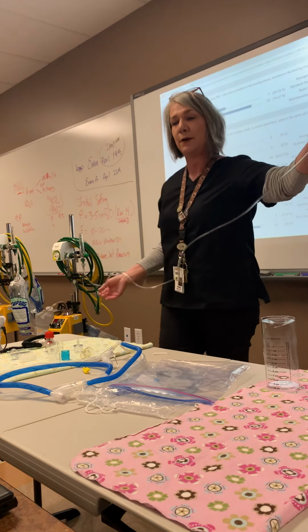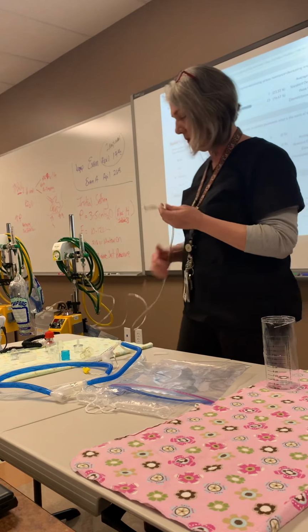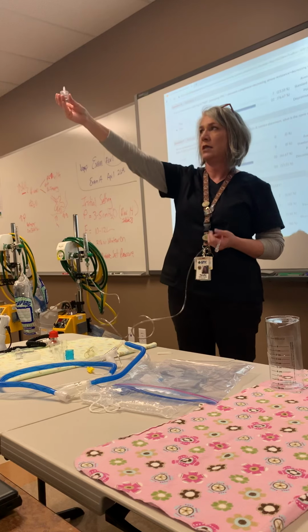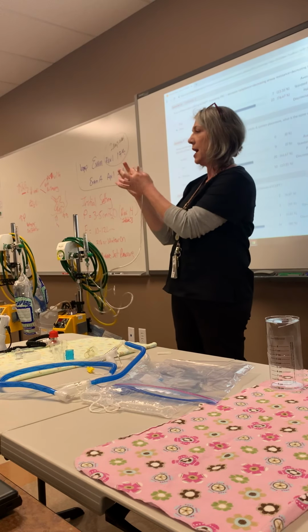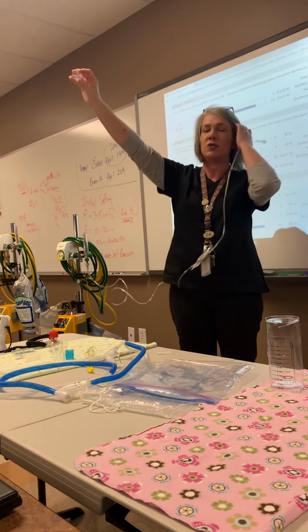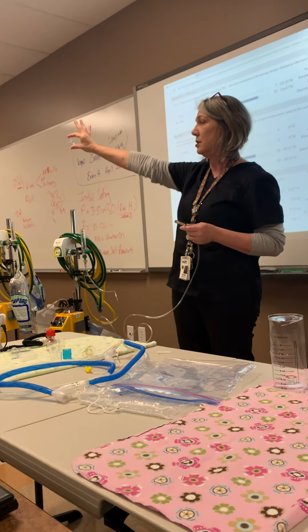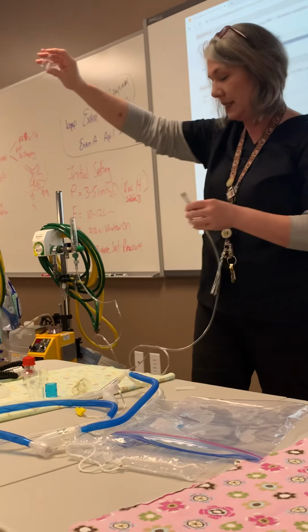Okay, next. Next is your O2 nipple adapter. Okay, so O2 nipple adapter. So it has the Christmas tree on top, but it has this nice 22 adapter on the other end, hence why it's called O2 nipple adapter. O2 nipple adapter.